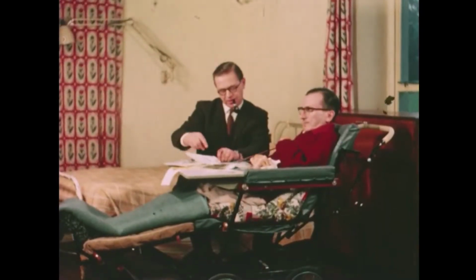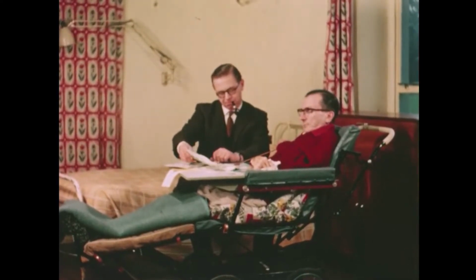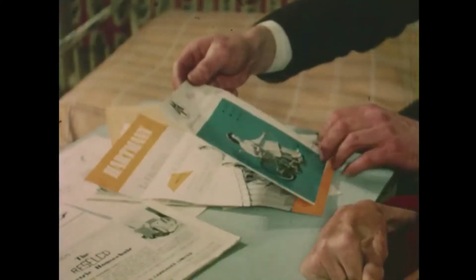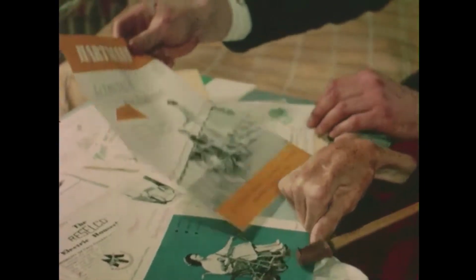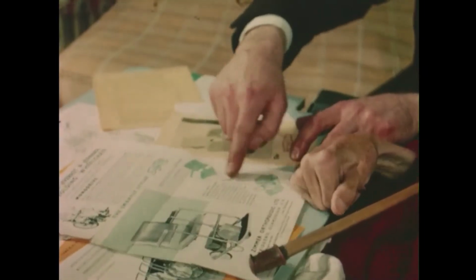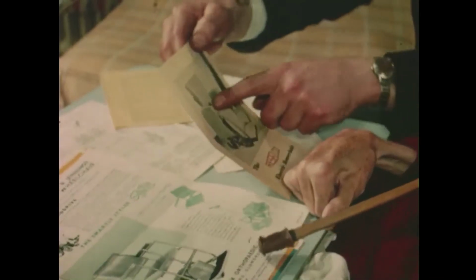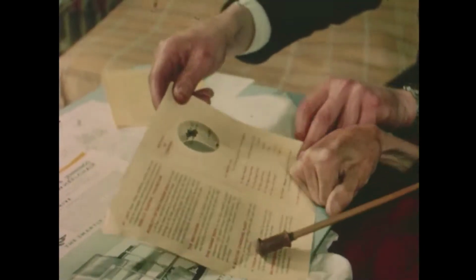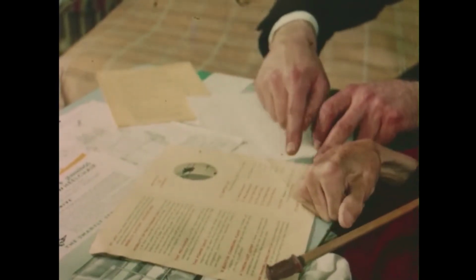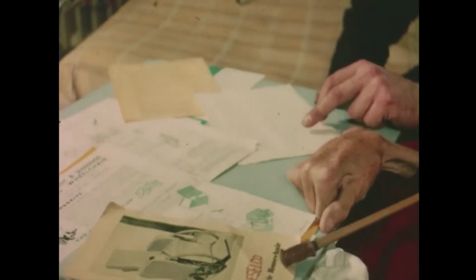Frank Spath was immobile for 25 years. His brother Jack, a commercial artist whose hobby is engineering, was sure that Frank could drive an electric chair. Frank has no grip in his hands, so he couldn't drive a single-engine type with a tiller control. But some chairs have engines on both wheels, like tanks, so that they'll turn to left or right by bringing in one engine or the other. Jack was determined to invent a control that Frank could manage with his very small range of movement.